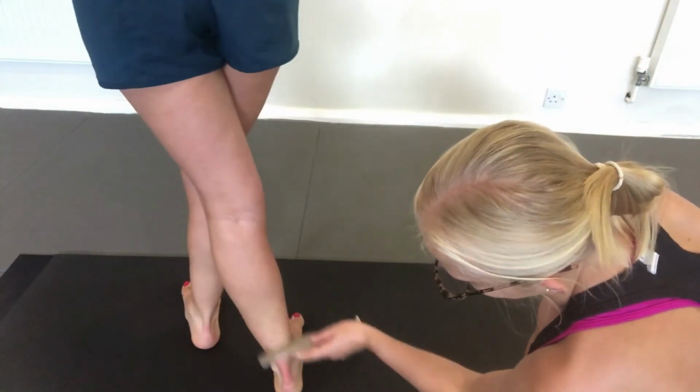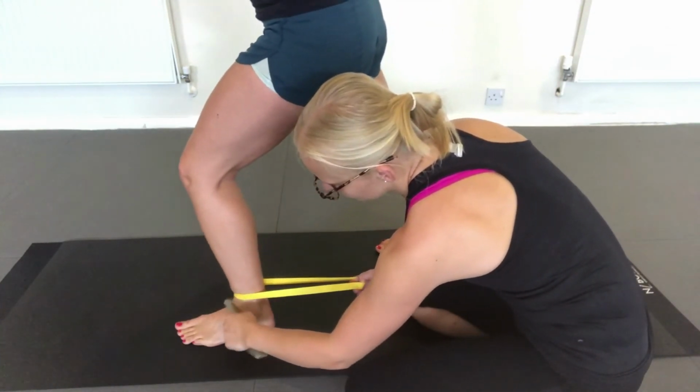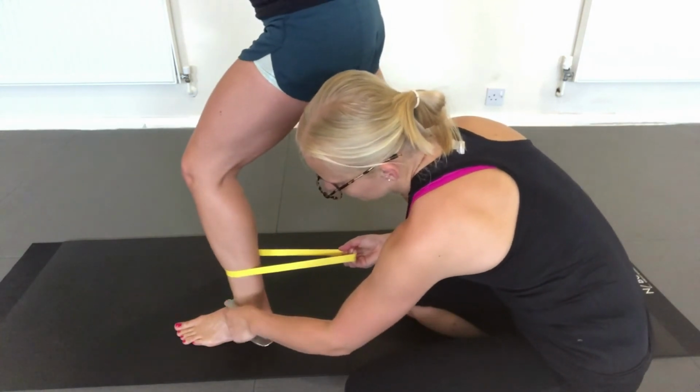And then finally, we can add a little bit of load and added resistance, so taking the resistance band around the distal shin, and then from there, taking the foot into dorsi and plantar flexion.